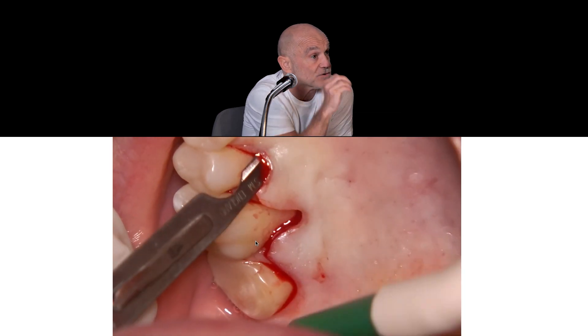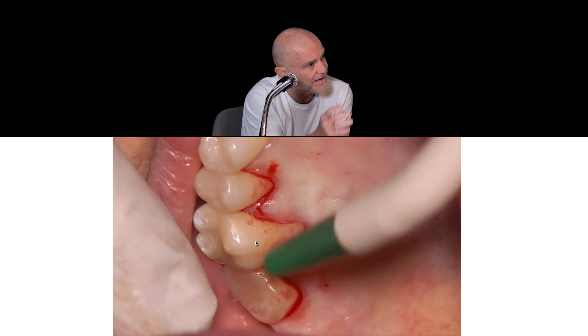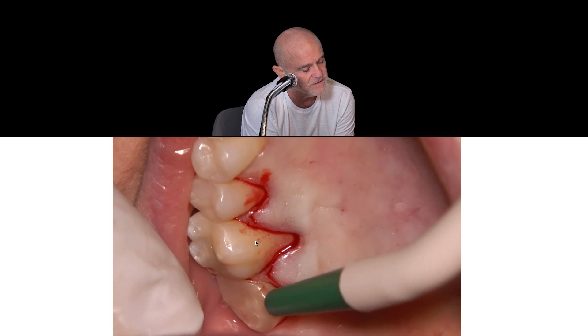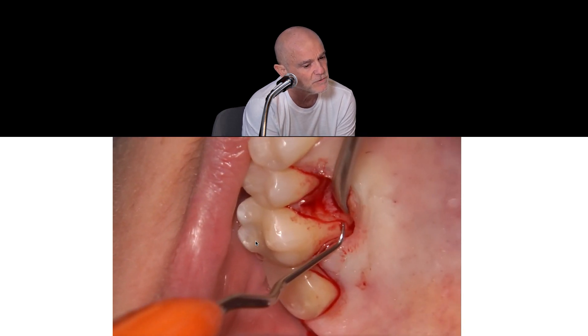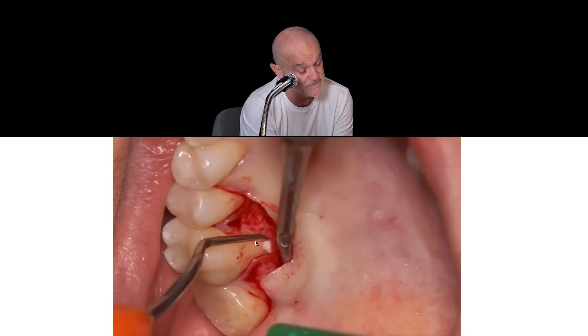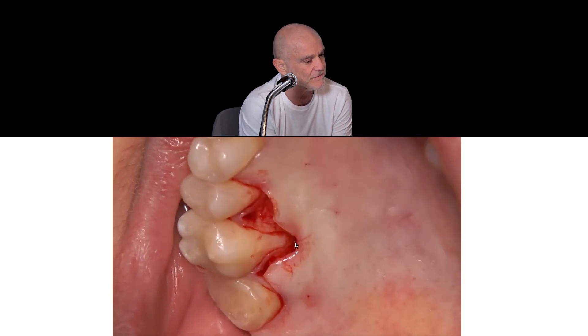The palatine flap is the one that has to give vascular supply. It has a connective graft that will only be partially covered by the palatine flap, because there is no possibility of coronal displacement. So the envelope is a mesial partial-thickness surgical papilla and a distal partial-thickness surgical papilla — partial thickness mesial and distal.